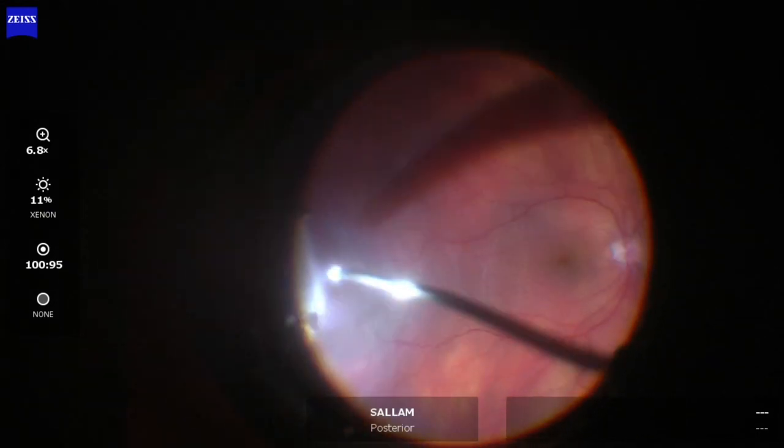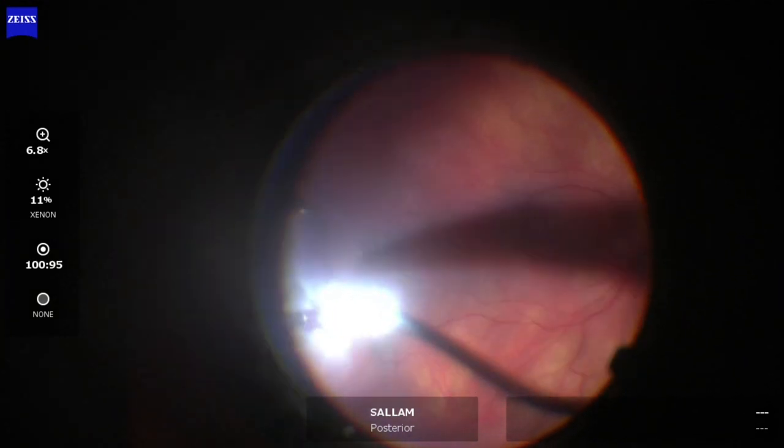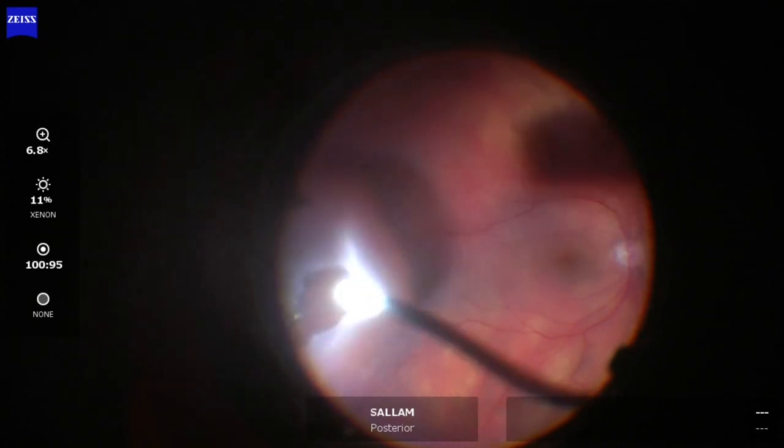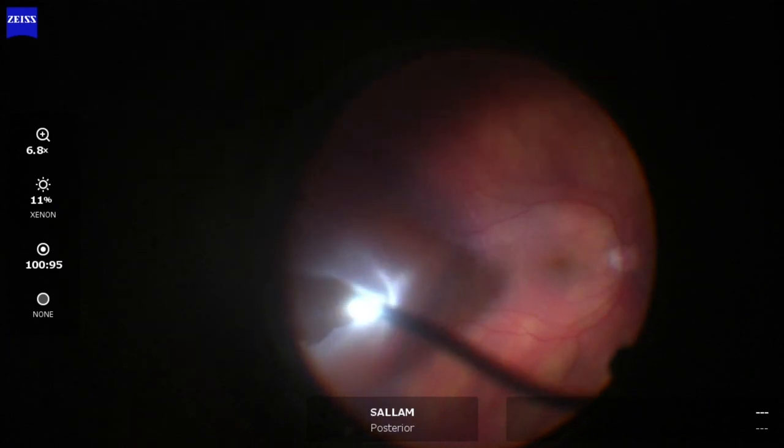Here I'm removing the vitreous as well as some suctioning of sub-retinal fluid to decrease the height of the detachment.